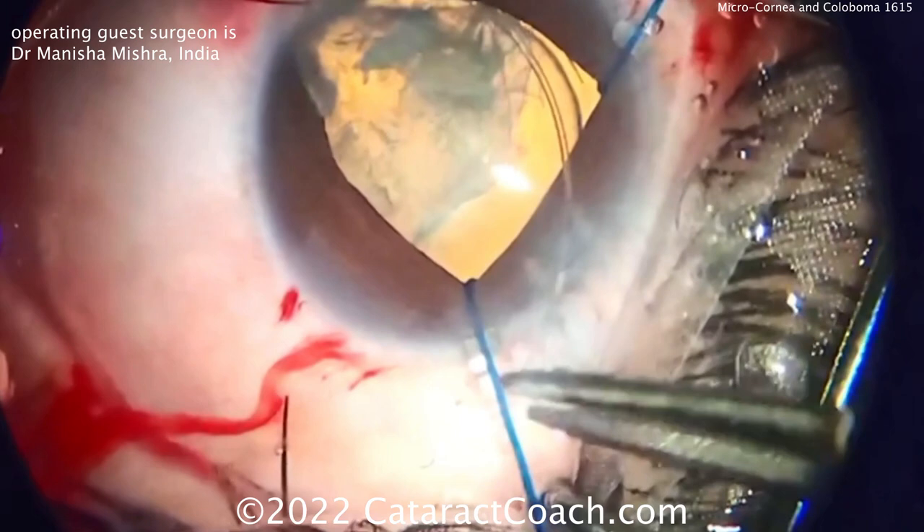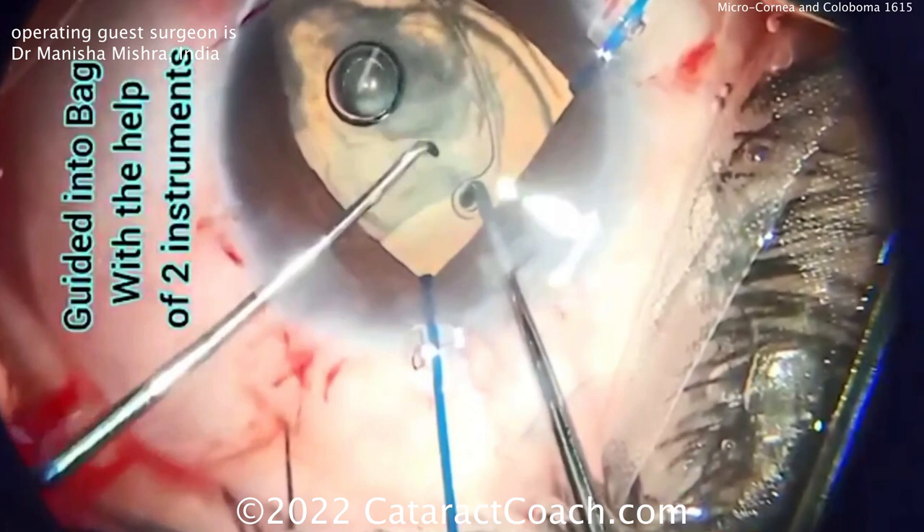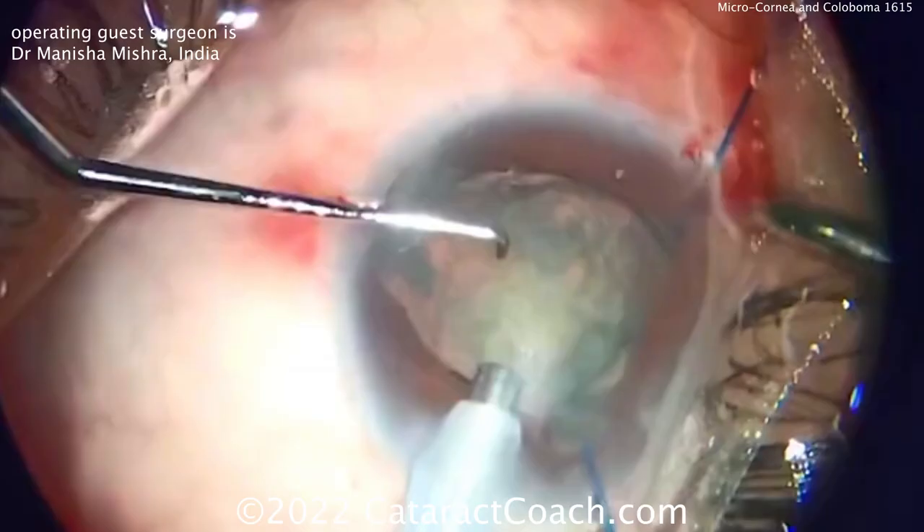This is a challenging case for sure. Sometimes in cases like this you need more than just a CTR — you may need a capsular tension segment or a Cionni ring or something similar. Now getting that into the capsular bag using a couple of Sinskey hooks, and it's delivered in there nicely.